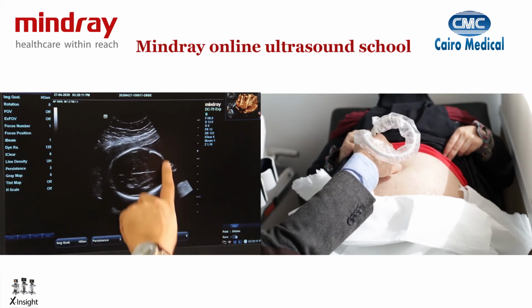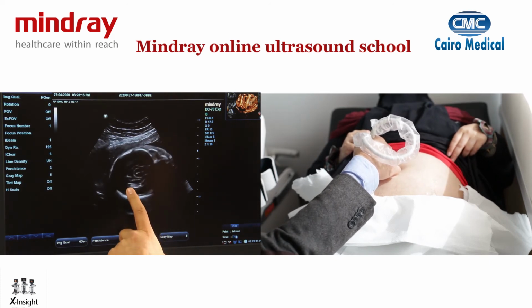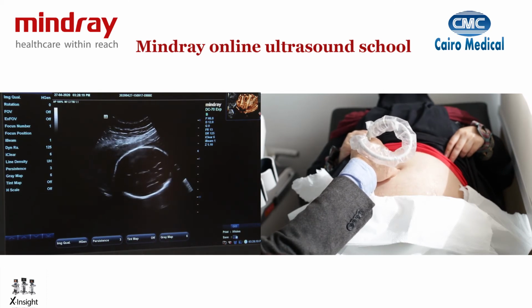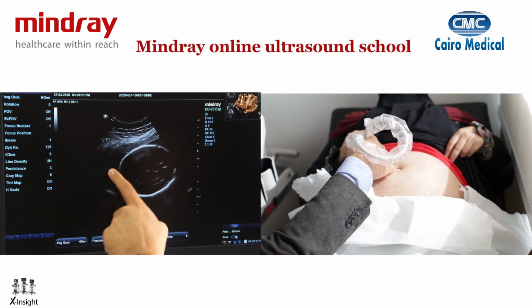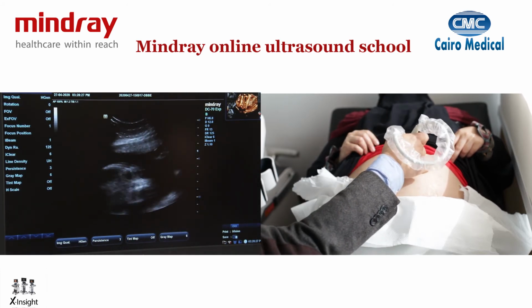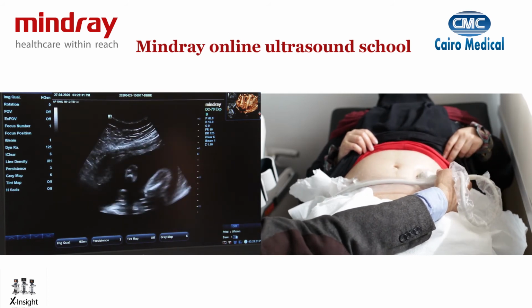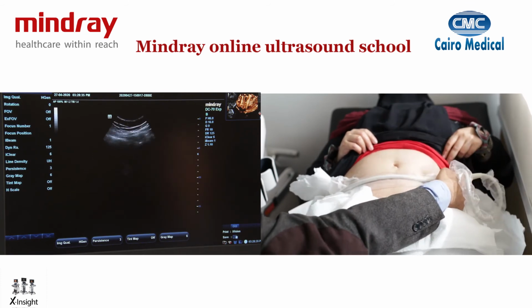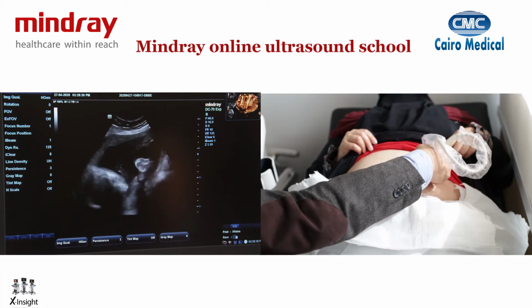And in that view, I can see the structures of the baby's brain. So I can see here the skull, the cavum septum pellucidum, midline echo. I can see the two thalami, and as well I can see the lateral ventricle of the baby's brain. So if I want to get the face from that view, the best thing to do is to get this midline to face straight upwards. So I'm going to move my hand across the whole abdomen of the mother to try and get this midline, so as if I'm moving across her complete waist, to try and get the midline to face upwards. Sorry, the baby has moved.